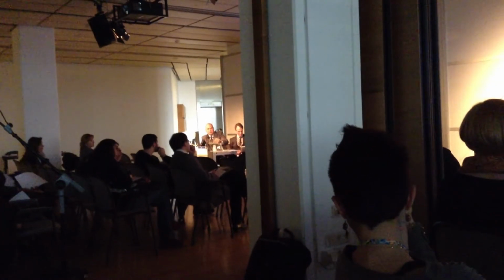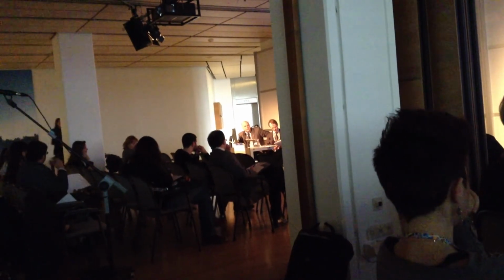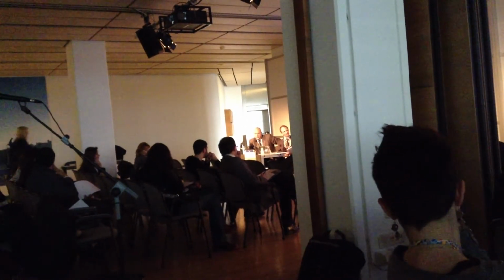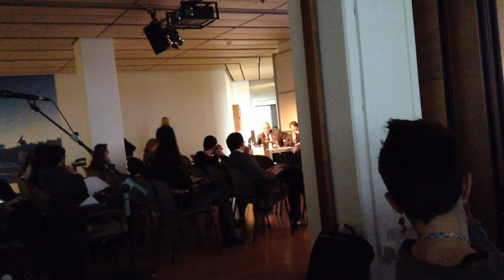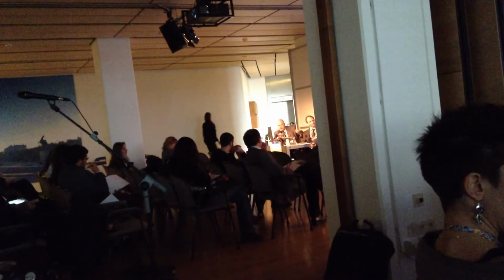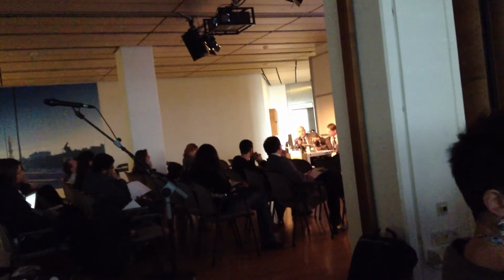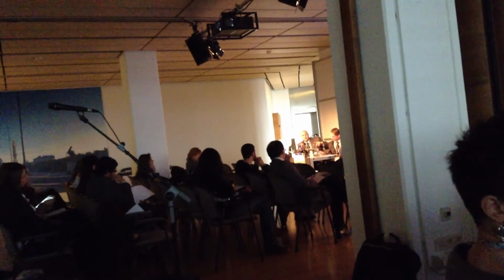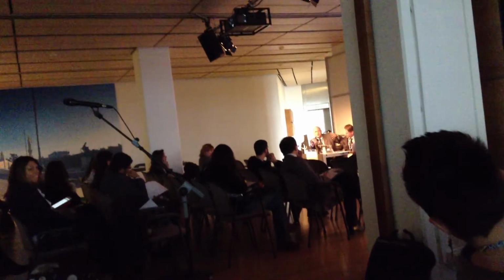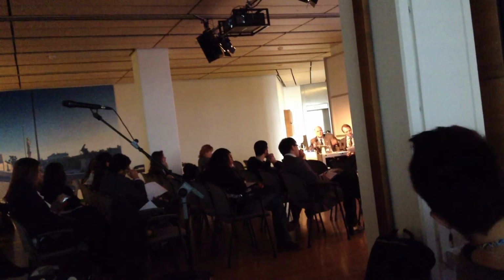Thank you very much. I would just like to raise another question in addition. Since FFE is generically an echo signal generated from free induction decay by means of a bipolar magnetic gradient, which is switching, do you think that the introduction of different flip angles may contribute to the diagnostic validity and diagnostic accuracy of the sequences? And what is your opinion of the introduction of double inversion recovery pulses in the inversion recovery sequences?